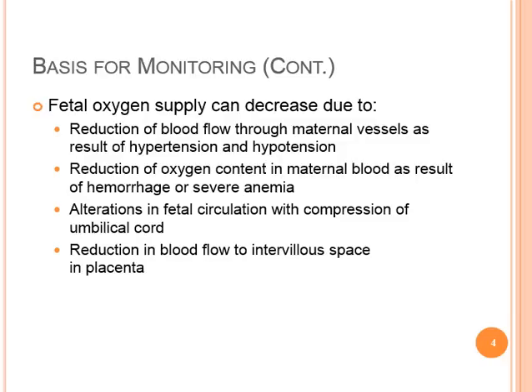An early deceleration is caused by head compression. Now, if the heart rate starts to go down at the peak of the contraction or after the peak, we call that a late deceleration, and late decelerations are caused by uteroplacental insufficiency.